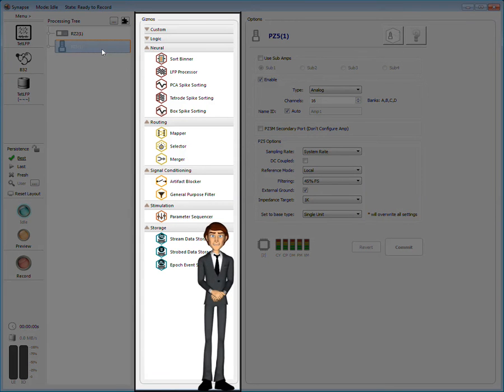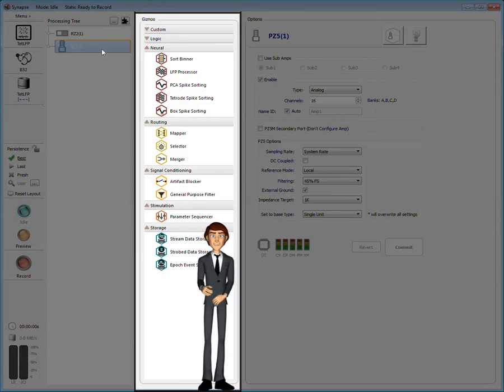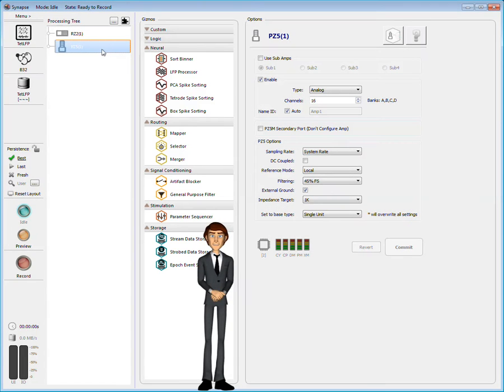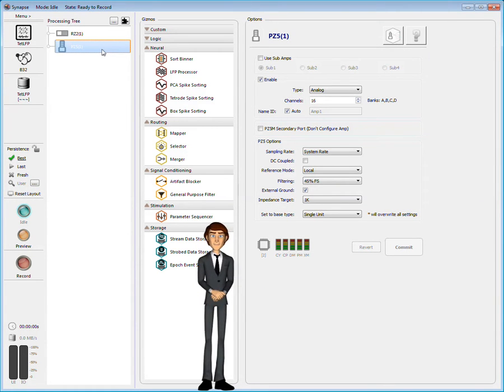Gizmos that can be added to this device are displayed in the gizmo list. PZ5 hardware options are displayed to the right.